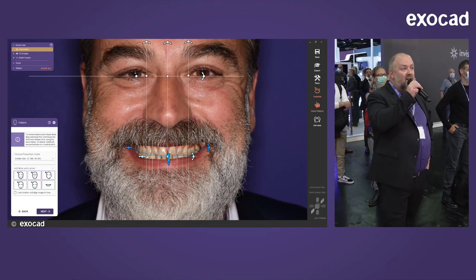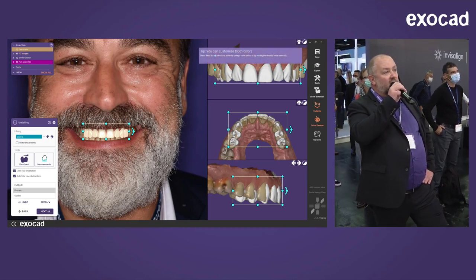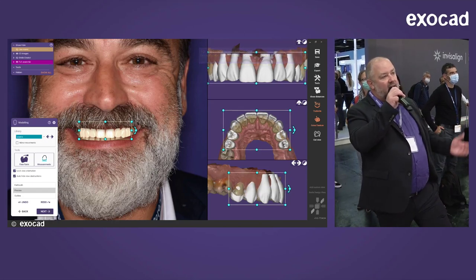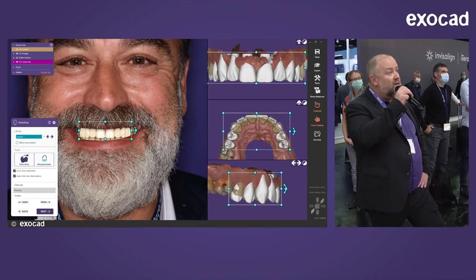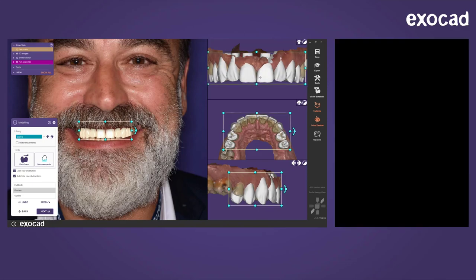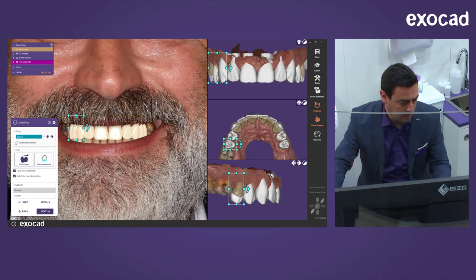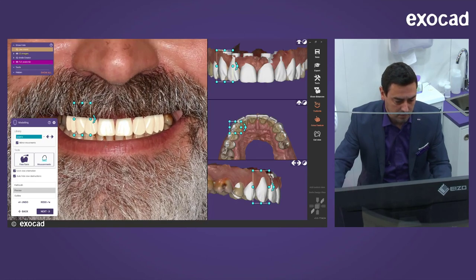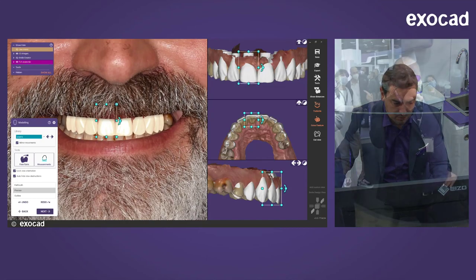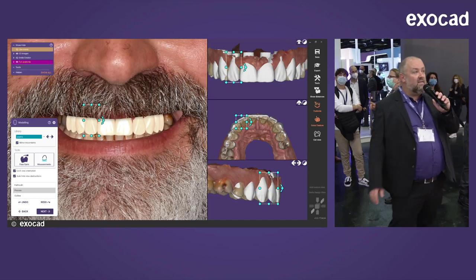Now we go to the smile design step — all previous steps were just preparation. You could even do this together with the patient, as it only takes a few minutes. You could send the picture to the patient, or use the WebView option: upload to our server, send a link to the patient, who can open it in a web browser — no software or license required — to view the result in 3D. That's the first visual outcome to discuss between dentist and patient, or between lab and dentist.